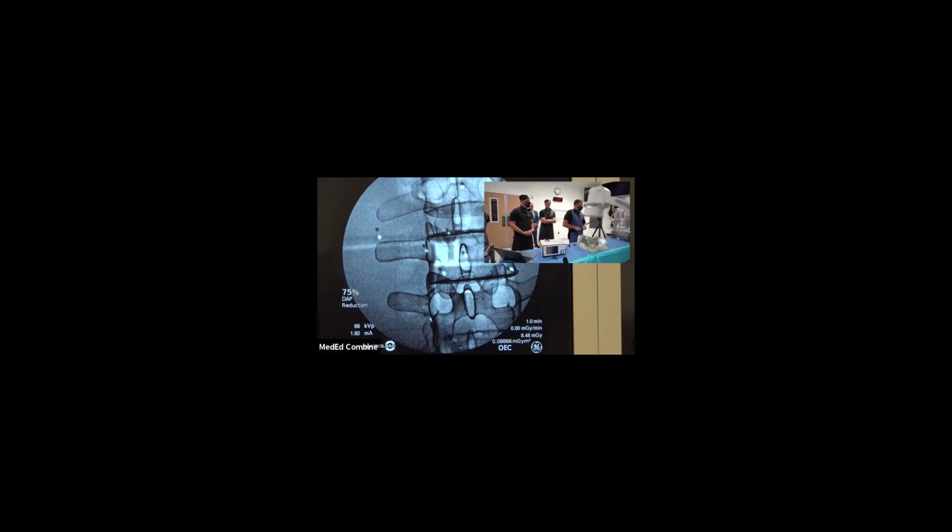Okay. Up to the head a little bit more. All your patients will have pedicles that look just like that. One right there. That's great. It's mandatory. Yeah, these are beautiful pedicles. If I screw this up, I'm not gonna hear the end of it. Between Doug and Chad, if I screw this up, it's gonna be bad. We're gonna take you out and shoot you. That's what we do in Texas when somebody doesn't do well. That's good. I'll do that for you.